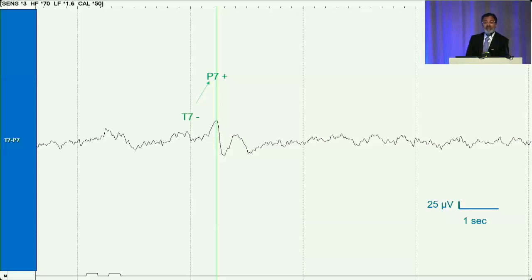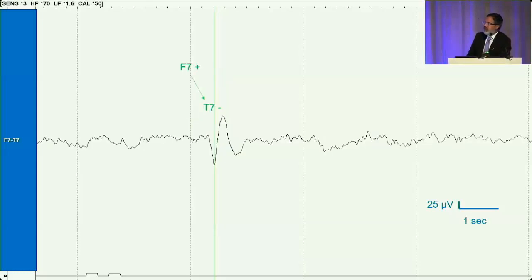Now, our lives are made simpler by the fact that the vast majority of epileptiform activity in the brain is a negative polarity event. You remember the slide that we talked about a few moments ago, where layers 2 and 3 interneurons are creating a negative sink at layers 2 and 3. That's how negative epileptic activity is occurring. Most of the time, epileptic activity is a negative polarity event. Therefore, if you see a negativity where it's maximum, that is where the epileptiform activity is situated.